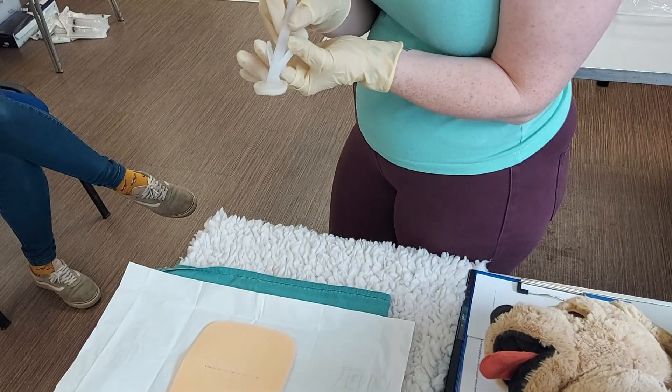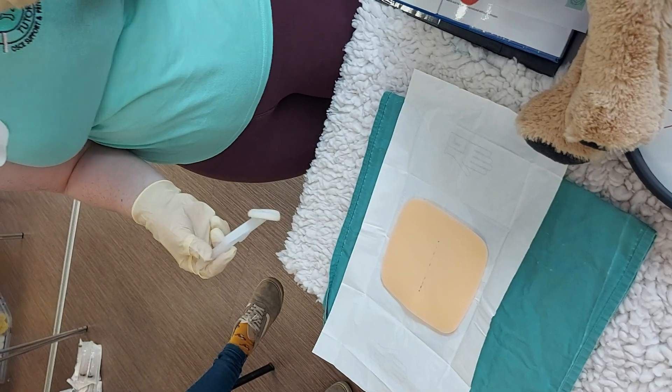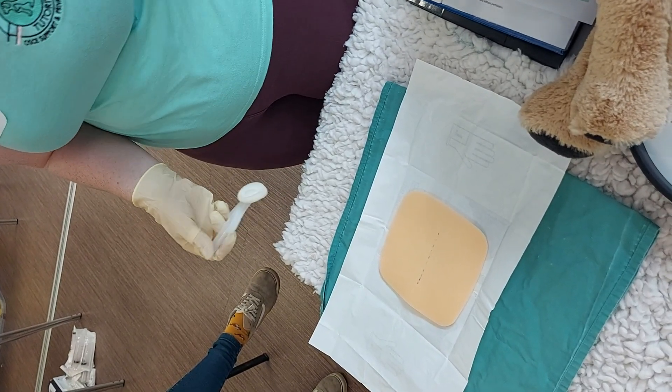You would snap your ChloraPrep, opening it like a book. Check your fob watch and aim to start on the 30-second hand — put it on a nice even number for yourself. Don't start on like 25 and have to try to do the math in your head.